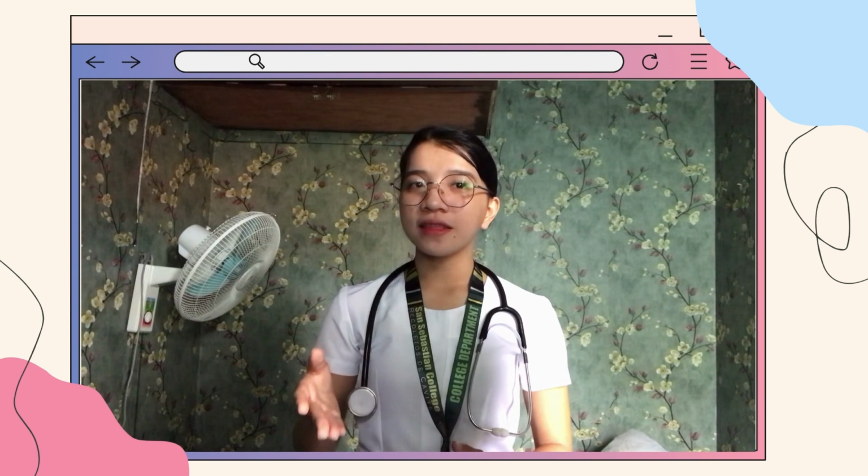In assessing the patient's vital signs, we need to know how to measure the body function of our client by the use of four main vital signs. The four main vital signs are, first, body temperature. We must know the normal body temperature or clinical signs of fever, and also know hypothermia. The next is pulse rate.